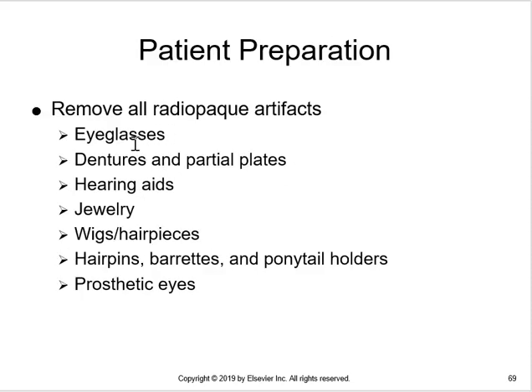Remove any kind of artifacts, so eyeglasses, obviously; dentures need to come out, hearing aids need to come out, any kind of jewelry, hairpieces, any kind of wigs need to come off, hairpins, barrettes, ponytail holders, and prosthetic eyes if the patient has a glass eye. That's going to show up very boldly on the image.